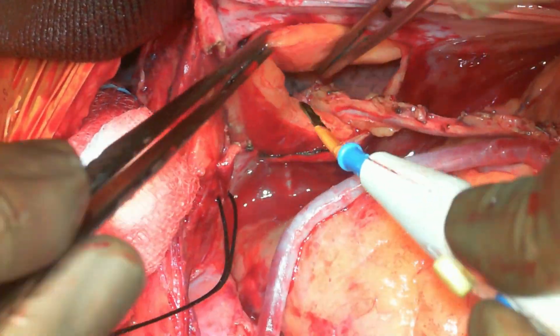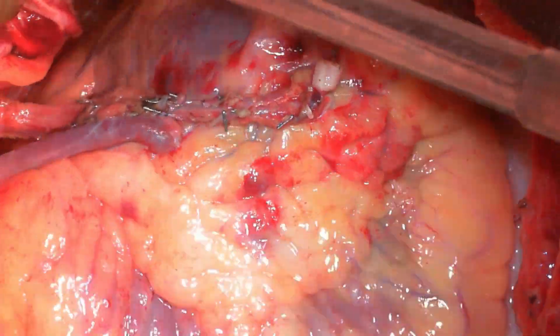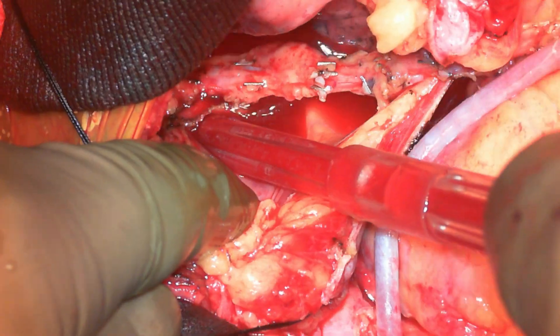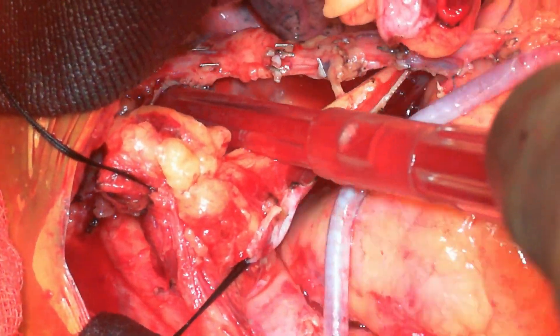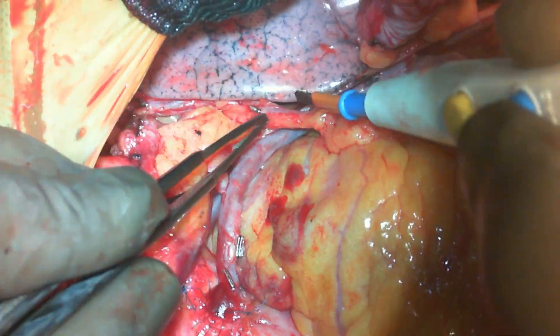As you can see, once that is done, the LIMA passes clearly onto the LAD without any stretch, and the left lung is fixed.